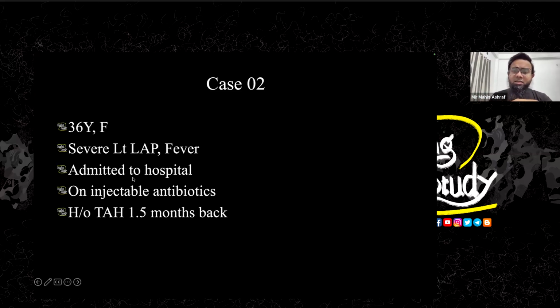So the next case is a 36-year-old female patient who complained about severe left lower abdominal pain with fever. So we thought about some inflammatory condition, hopefully. She was admitted to hospital and was given injectable antibiotics. Now, there is a history. She had gone through a total abdominal hysterectomy 1.5 months back. Now she came with severe pain and fever.